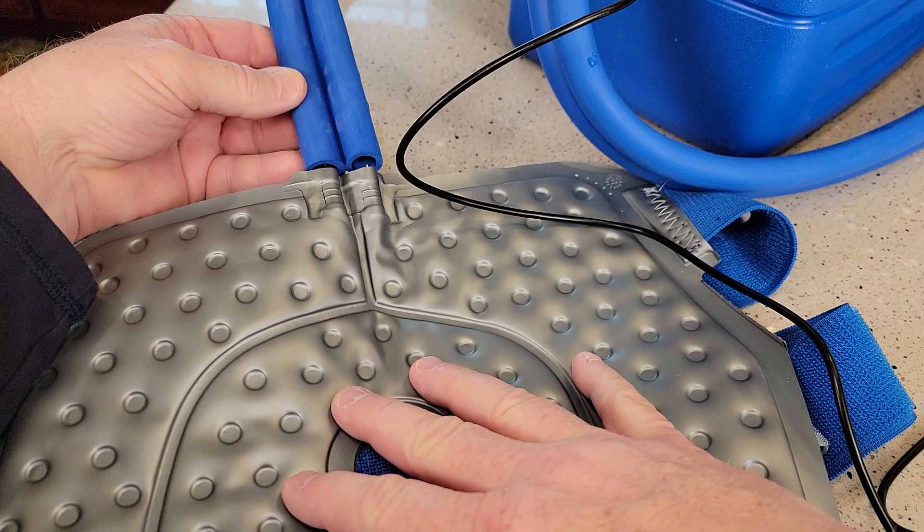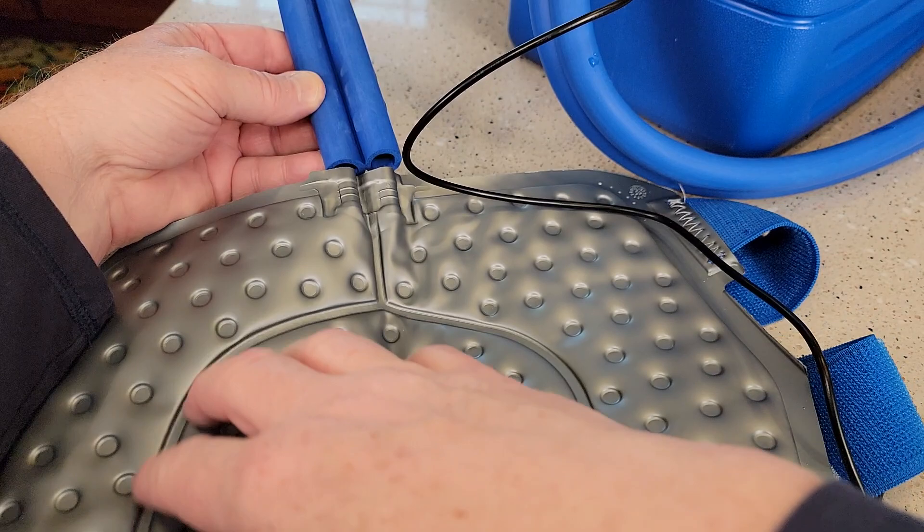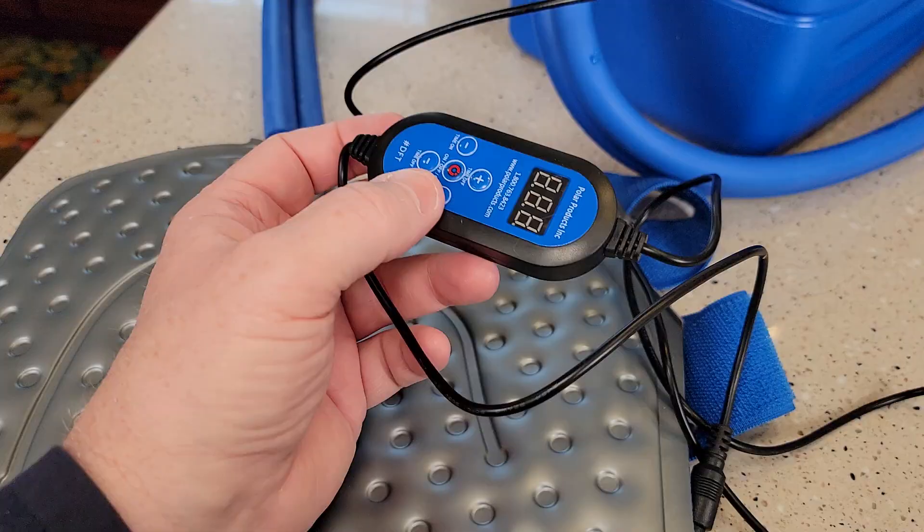So when you turn it on, the cold water is going to come in. It's going to flow through this pad. Then as the water gets warmer, it's going to go out this other side. So it's always pushing water in and sucking water out.